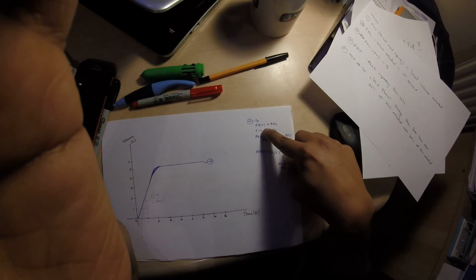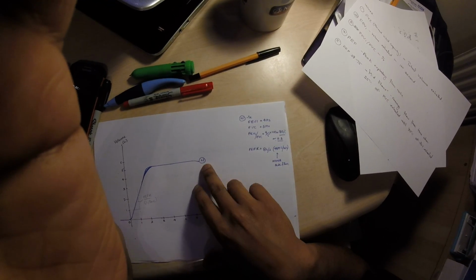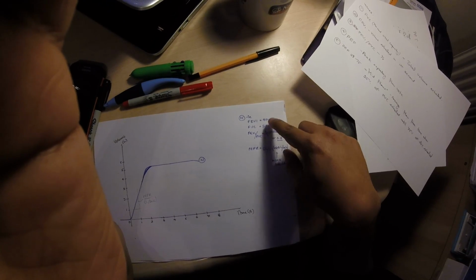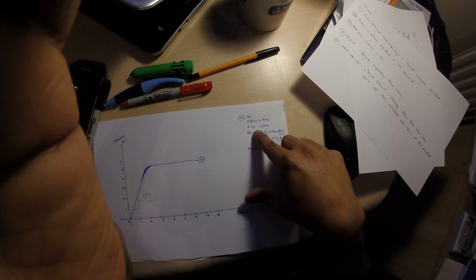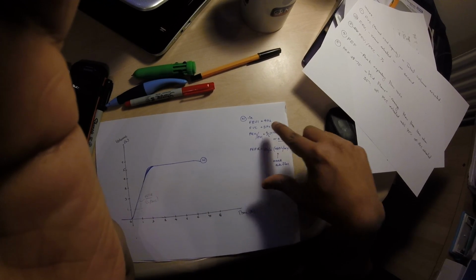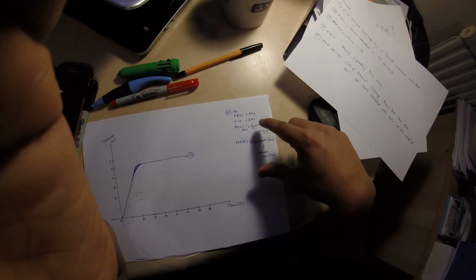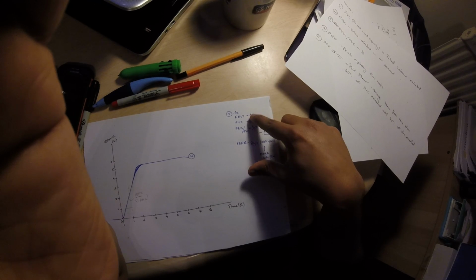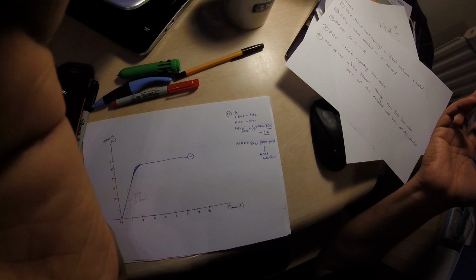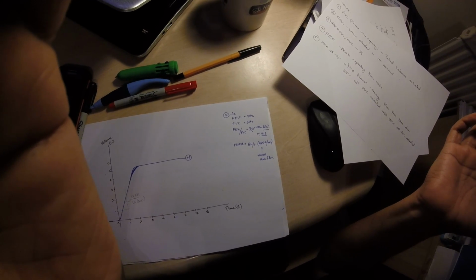The forced expiratory volume on a normal individual is expected to be about 4 liters, and forced vital capacity is about 5 liters. The ratio obviously is divided between these two. It's 4/5, which can be written as 80% for a normal adult or 0.8 as a ratio.